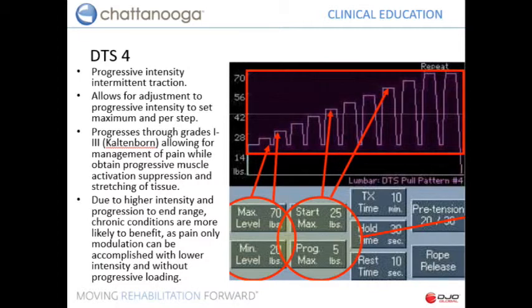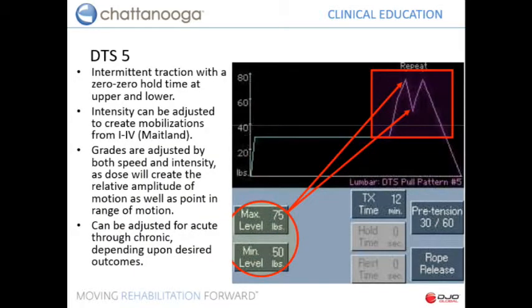Their number one cause of neck pain is radiculopathy and myelopathy, and so multiple levels of degeneration. So what this does, if you think progressively of getting from the upper vertebrae down to the lower vertebrae by increasing the level of intensity progressively, it's a really nice mobilization in the full spine area of the cervical or the lumbar, and it tends to be relatively comfortable, and people don't tend to experience a lot of side effect or soreness from that.